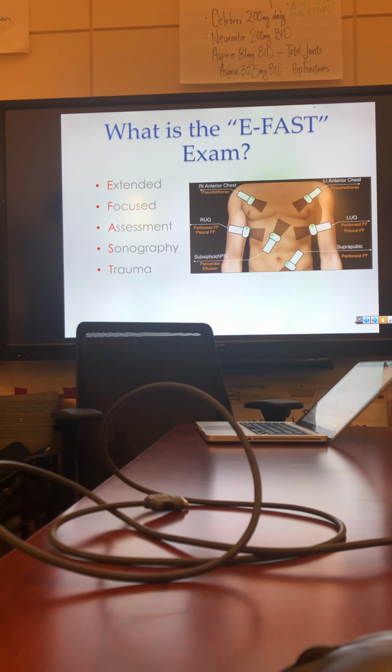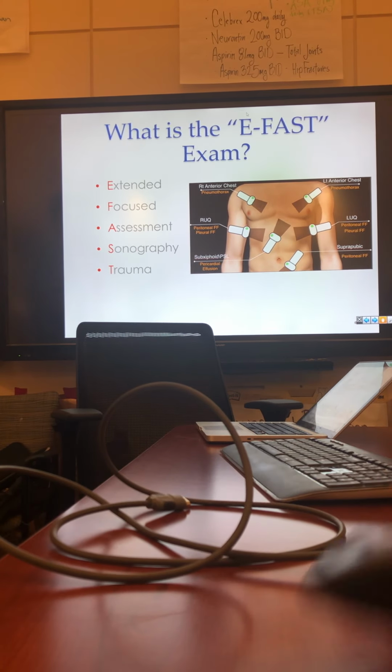Dr. Coletti wants us to do these as much as possible so that we get the practice. But we shouldn't be delaying CAT scan to do this. Yeah, I guess the reason why I was wondering is because we got dinged for not doing them, and I'm like, well, what if the data shows that it's better to bypass and go straight to a CT scan, like on the stable patients or the high level traumas, then why are we getting dinged on it? Is kind of what I was wondering.